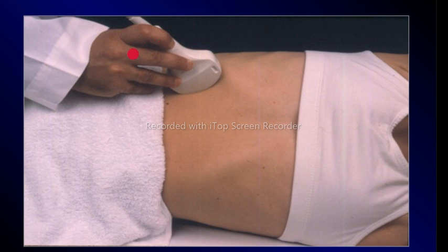It may fall forward, but be oriented like that. So you'd have to orient your probe in that direction to pick the longest image, the one that gives you the gallbladder in its widest dimension. That would be the true long axis of that gallbladder. For now, we're not dealing with technique. We are just highlighting sectional anatomy, just like the lecture, Introduction to Cross-Sectional Anatomy. We'll get to the details later.